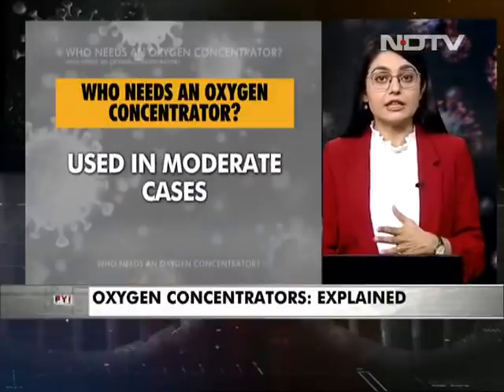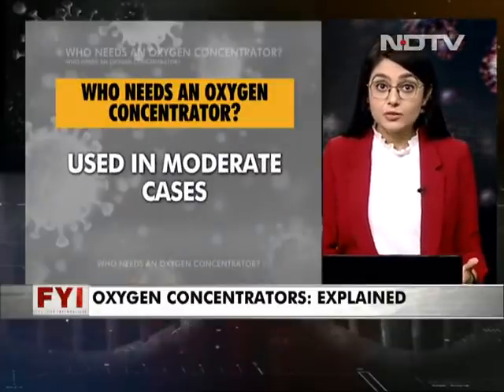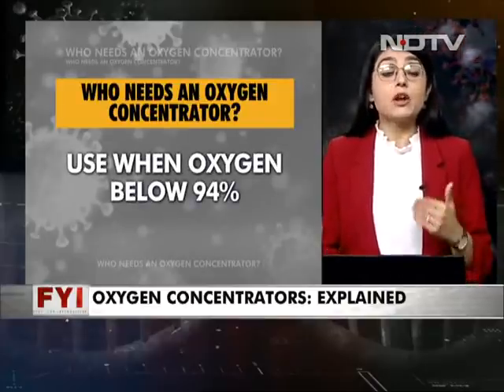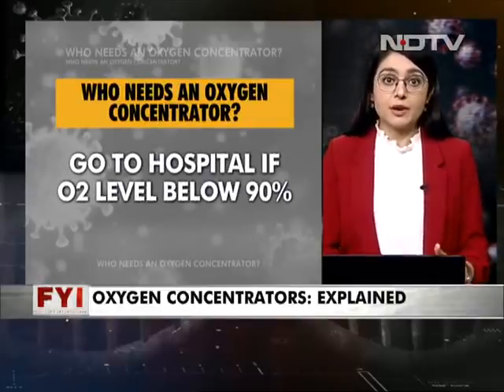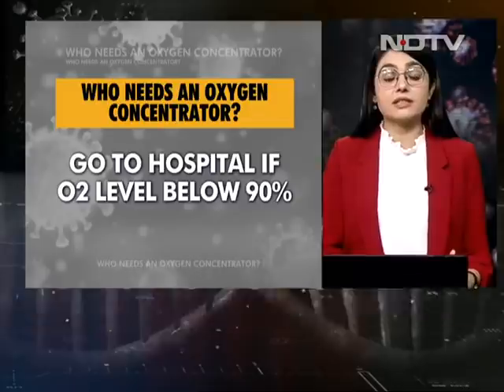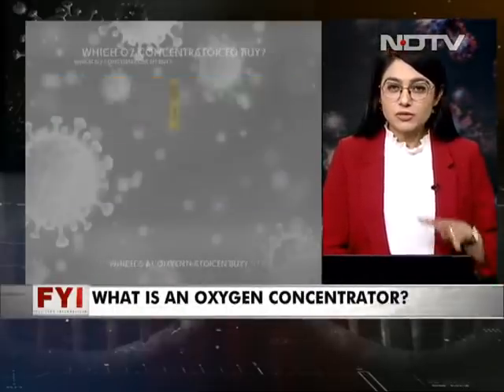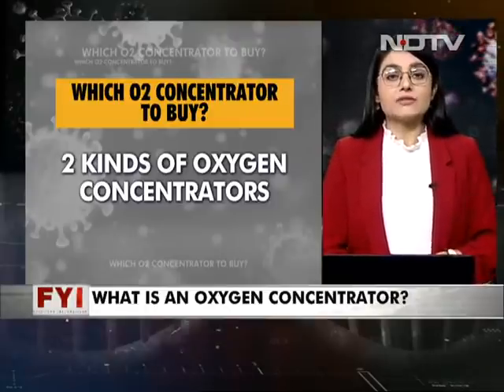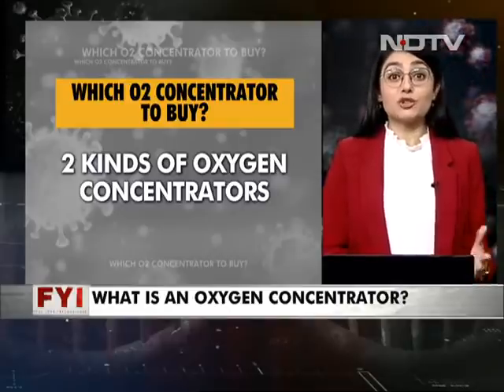Now, I know there's a lot of panic buying going on, but remember, an oxygen concentrator is helpful in several ailments. But when it comes to COVID, it can only aid moderate COVID patients, those whose oxygen saturation levels fall between 90 and 93, 94. It can be used in severe cases as well, but that's only to bridge the time before you actually reach the hospital. Below 90, you definitely need a hospital, because in those cases of severe respiratory distress, it is necessary that you provide oxygen that is almost 99% pure, and an oxygen concentrator is not up to that job.